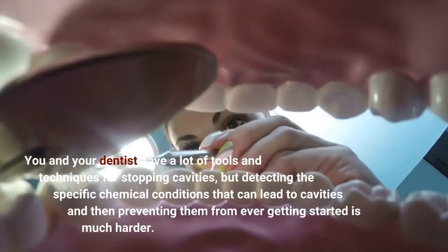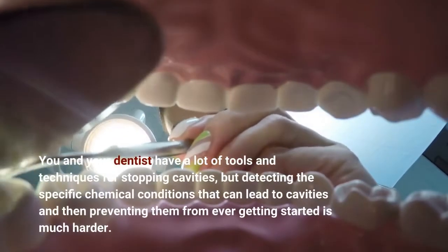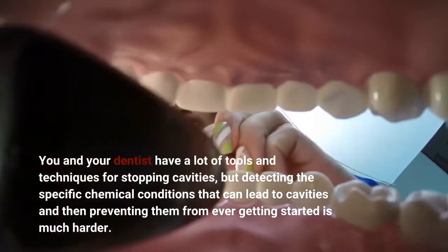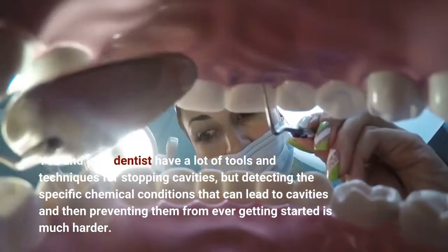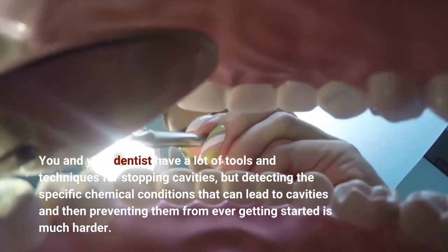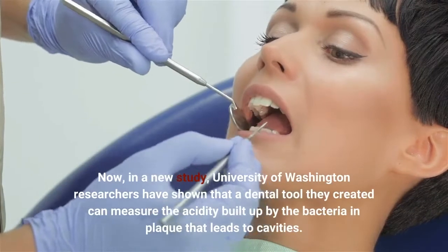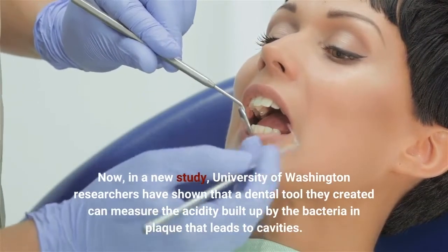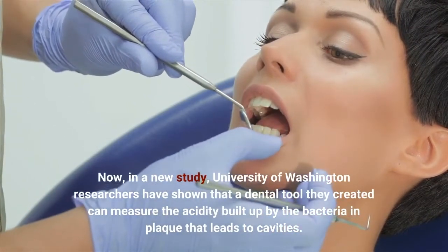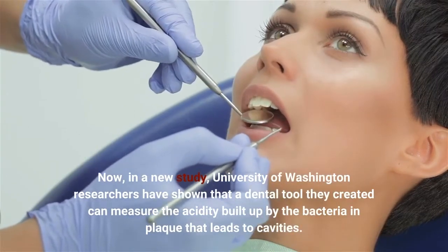You and your dentist have a lot of tools and techniques for stopping cavities, but detecting the specific chemical conditions that can lead to cavities and then preventing them from ever getting started is much harder. Now, in a new study, University of Washington researchers have shown that a dental tool they created can measure the acidity built up by the bacteria in plaque that leads to cavities.